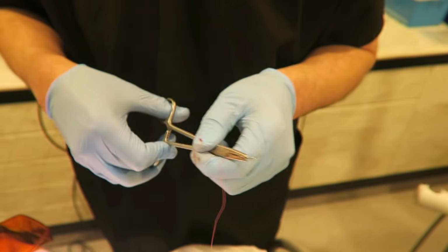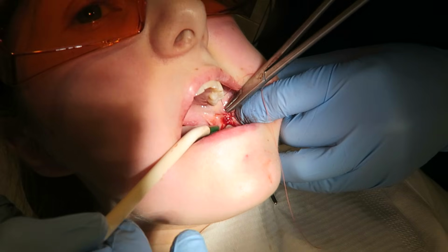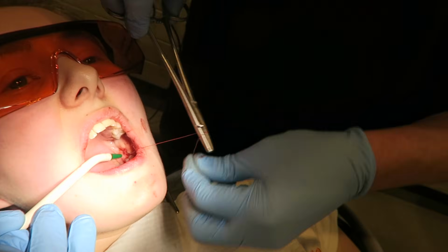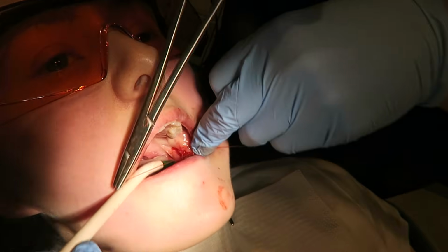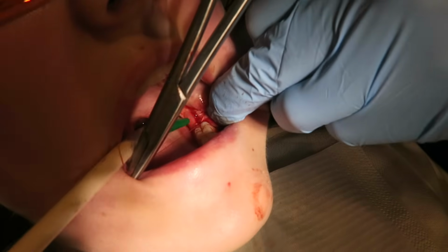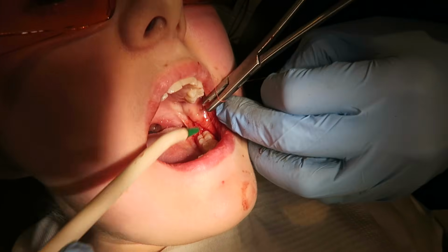I'm going to do another stitch. This stitch is quite important. So again, a simple interrupted stitch, distal to the 7. So 2 throws, pick it up from the tip, make sure it's tight, and then another one in the opposite direction, and always a third one just to be on the safe side.